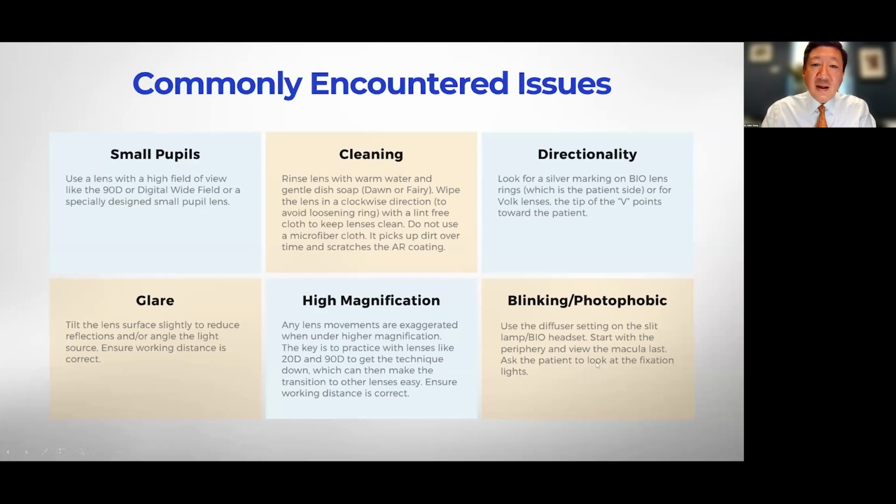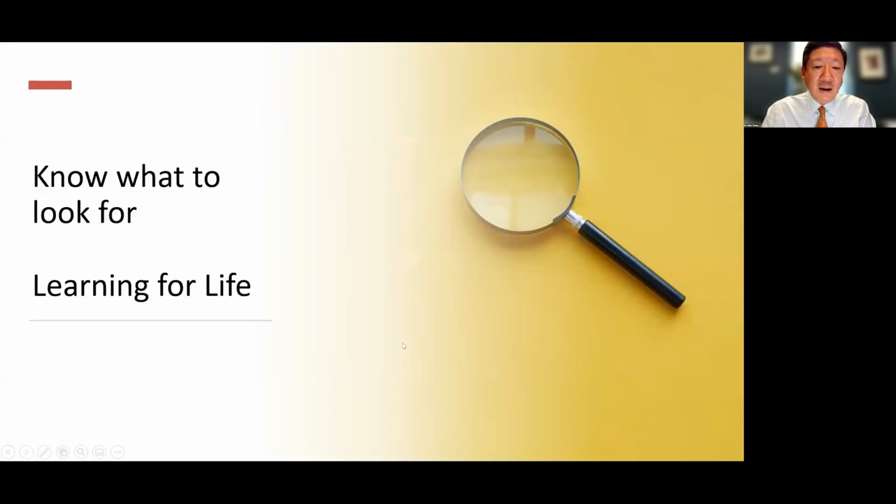And remember that this can be uncomfortable for patients, and that photophobia and blinking, don't hold the eyelid open for extended periods. Blink for the patient if you need to hold the eyelid there.